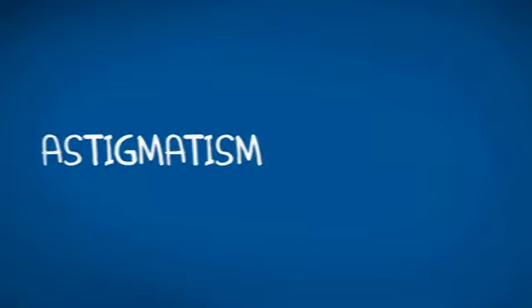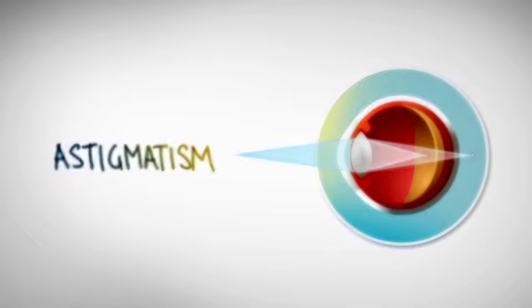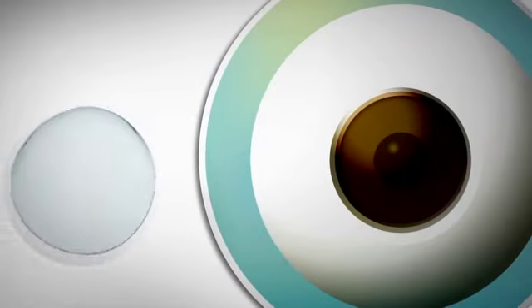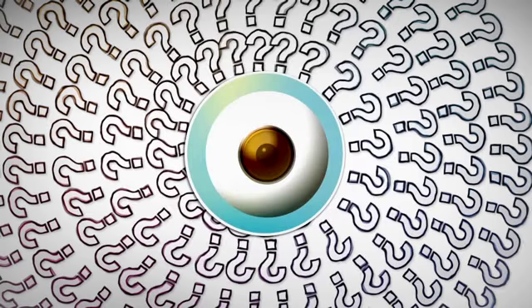In an eye with astigmatism, the parts of the eye that bend light are shaped so that they focus that light in two different places, leading to blurred vision. To correct this, contact lenses need to have two different powers, so they have to be precisely oriented and not rotate. Sounds tricky — so how's it done?